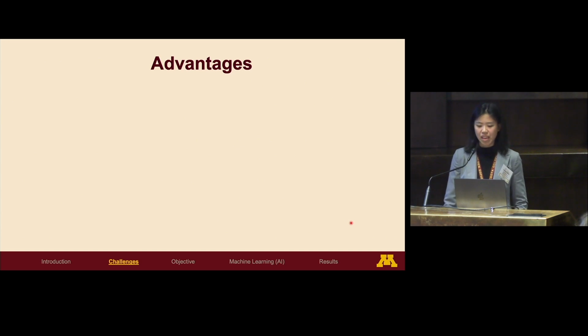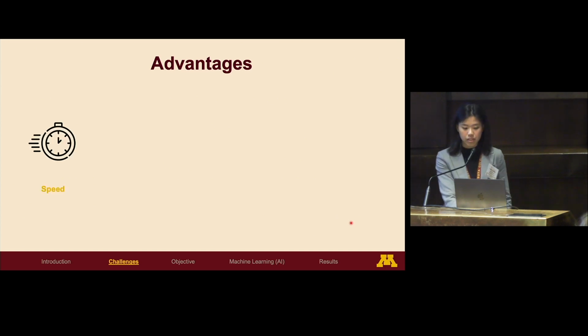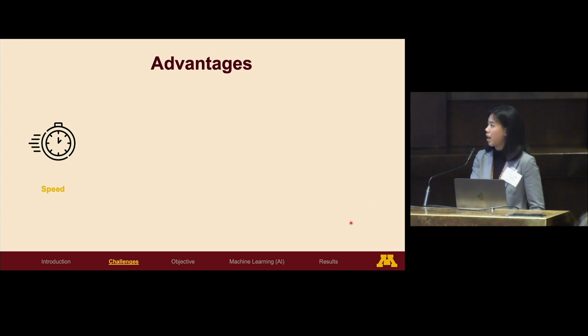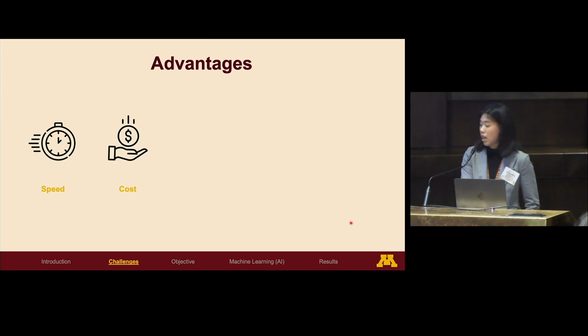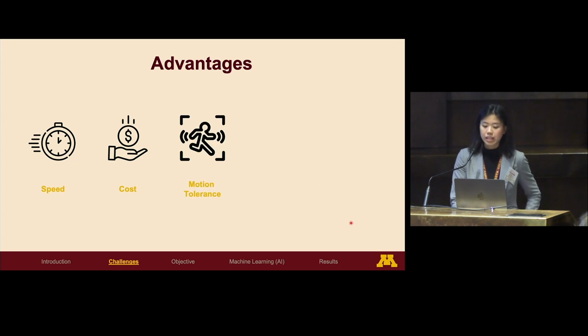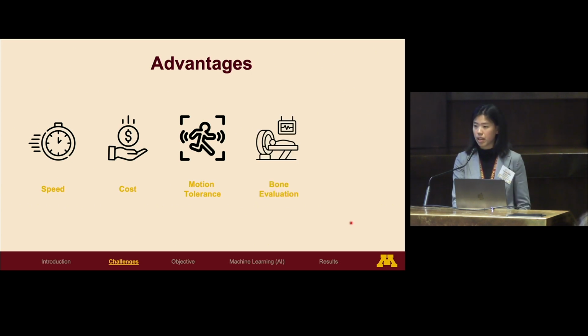So if chronic subdural hematoma shows up very similarly to the brain tissue on CT scan, why are we still using CT scan for diagnosis? Let's talk about some of the advantages of using CT scan for this condition, especially when compared to MRI scans. CT scan is generally faster than MRI, making it the preferred choice in cases of trauma and other acute neurological emergencies. And obviously, it's more cost-effective compared to MRI, as it can effectively rule out many neurological disorders immediately. CT scan is less sensitive to patient motion during the examination due to its faster imaging process.